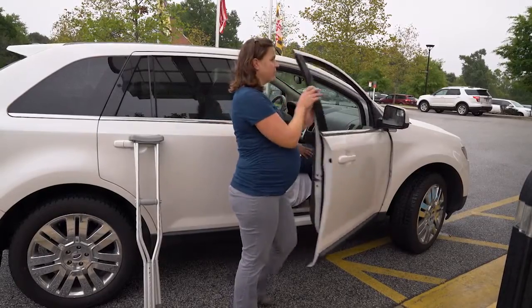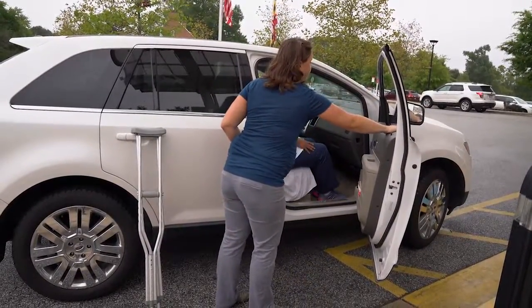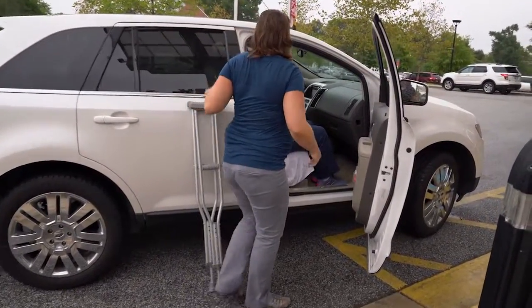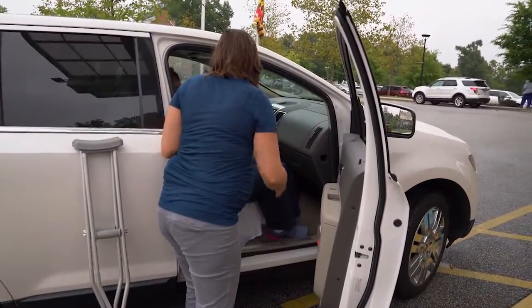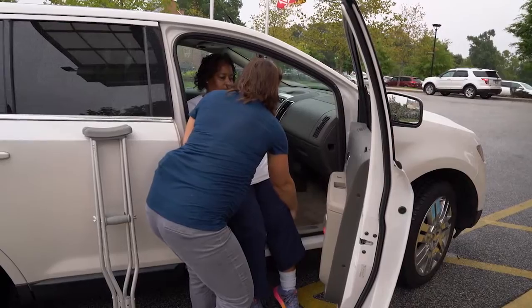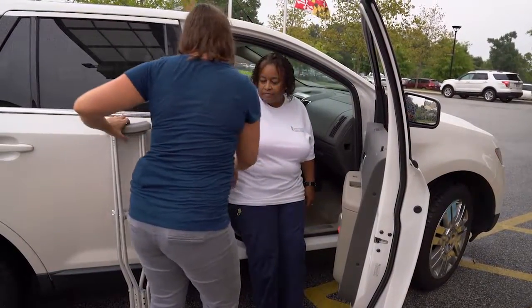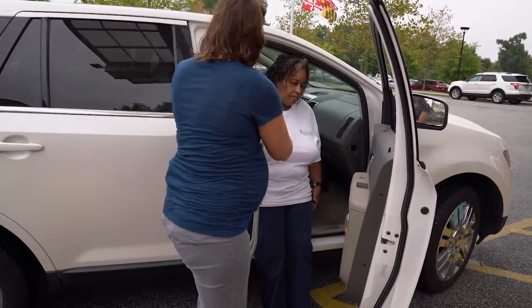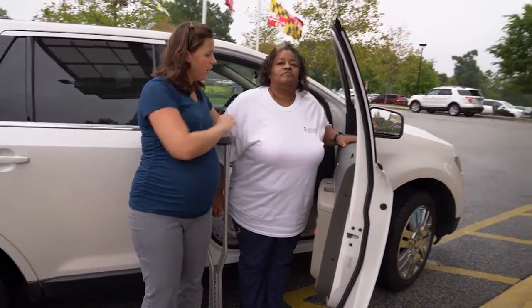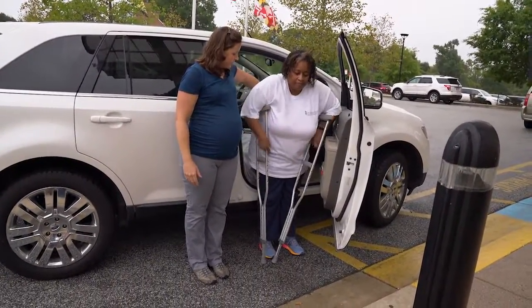Now that you're home, it's time to get your family member out of the SUV. Let's open the door. Again, you can use the window roll down as the arm or hand rest. We're going to go ahead and swing those legs out. I'll help you. Okay, now this is a little bit higher. I want you to scoot so both feet are touching. Perfect. Let's use your hand up there. Let's stand on up. Good. One crutch under each side. And let's go home.